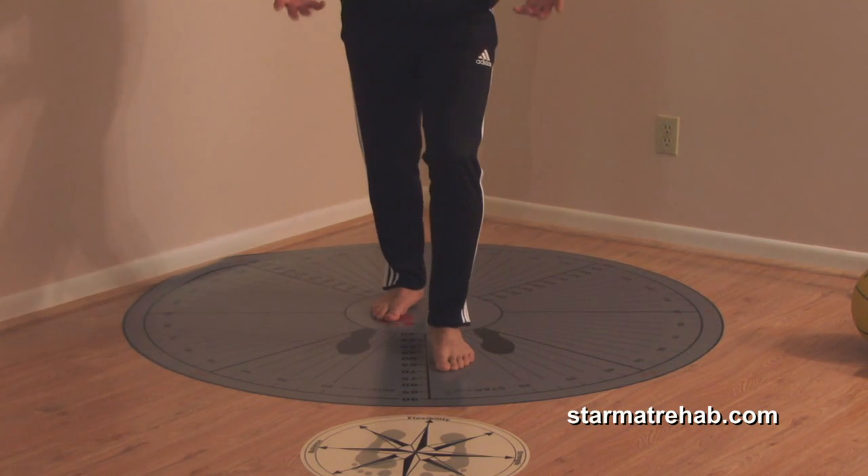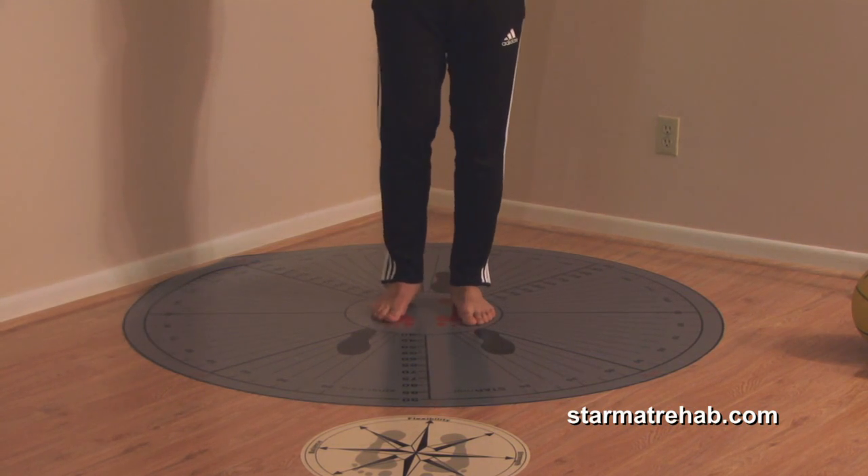I'm going to do the same thing on the contralateral leg. This was for a person who has recently post knee OA or high irritability. You can also give this exercise to somebody who's got patellofemoral syndrome with pain during aggressive exercises. We can add lunges — let's do star lunges.